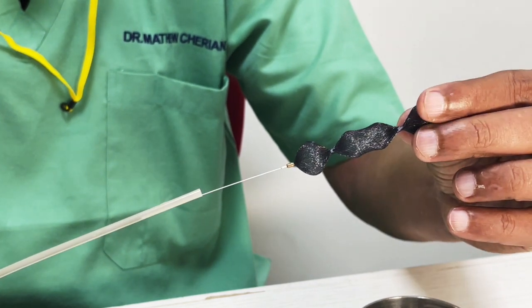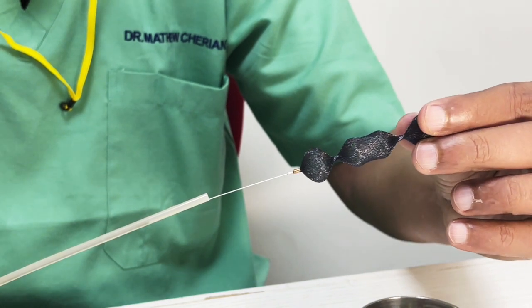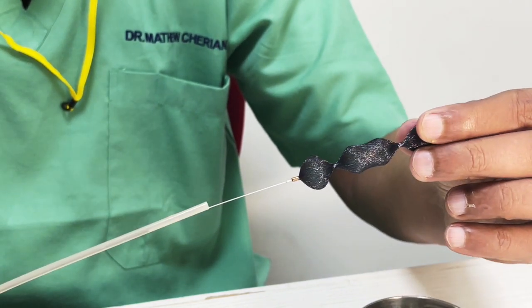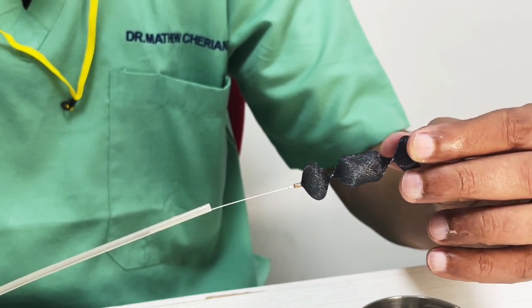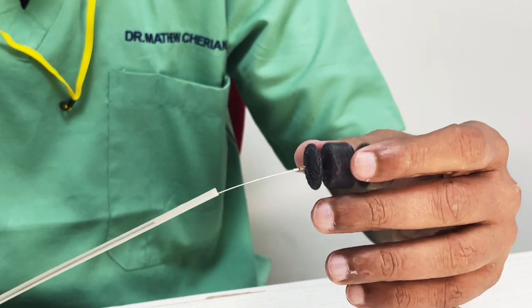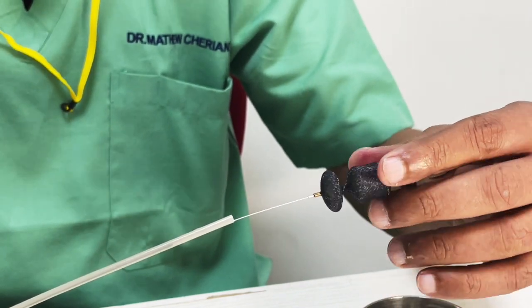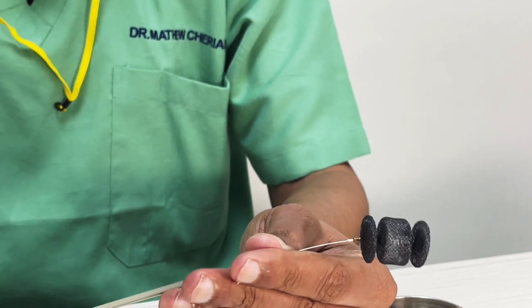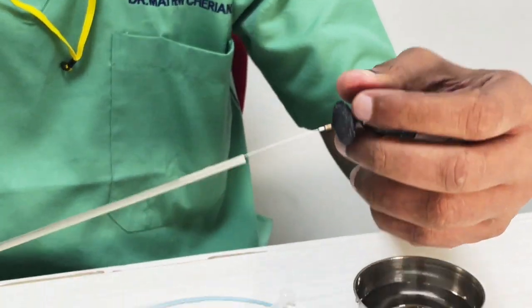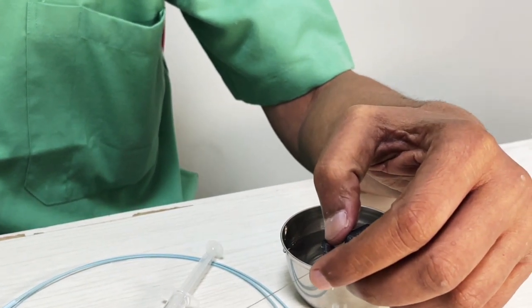So technically, remember, not only is there the advantage of controlled detachment, there is also the advantage of it being very, very secure, and you save a lot of money in terms of the number of coils you use. Once you have come to the right spot, it's very simple. You just have to rotate it. You connect the toggling device. I'll just show that technically.